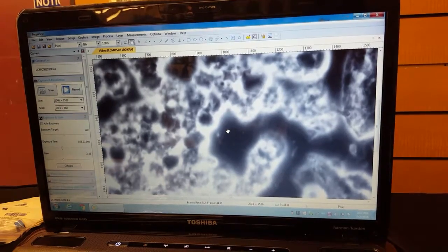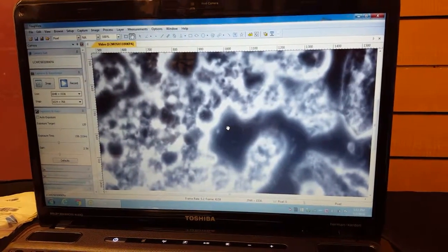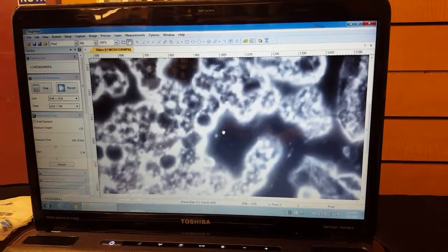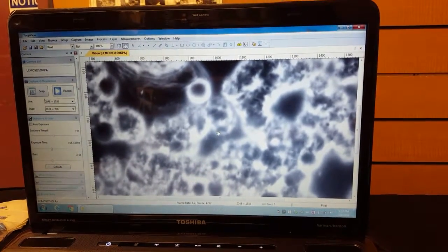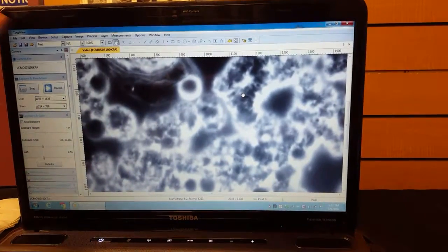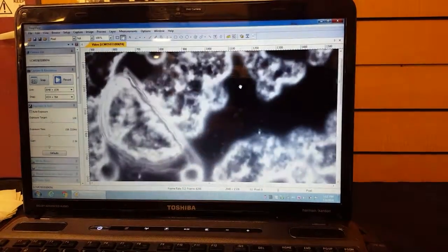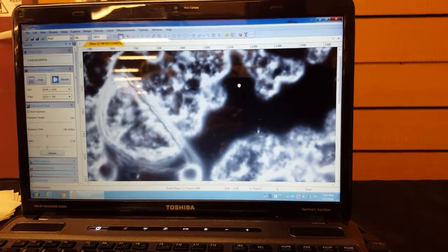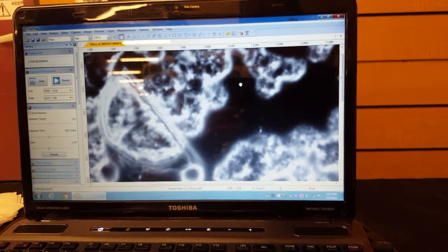There's some. Wow. Okay. Let's see if I can pull it up. This is funny. I can see some cholesterol in here too, but that's because you ate some beef. See if I can pull that up. Might be up there. Cholesterol. Yeah. So that's probably just because of what you ate.